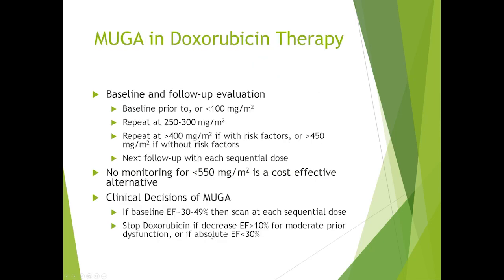Now, MUGAs, like I mentioned earlier, are used in chemotherapy, most specifically monitoring doxorubicin therapy. This is an outline of how a patient may be monitored.